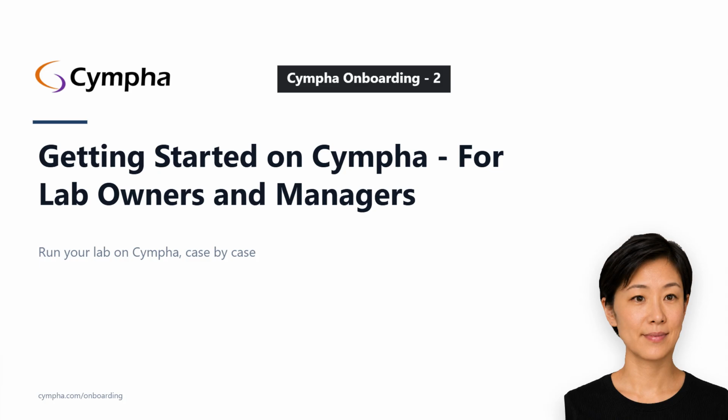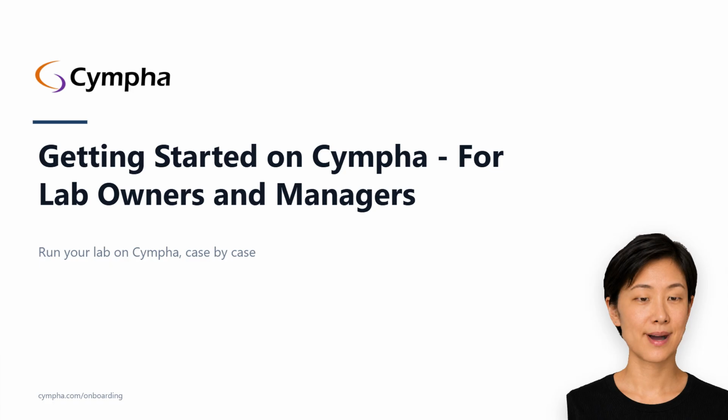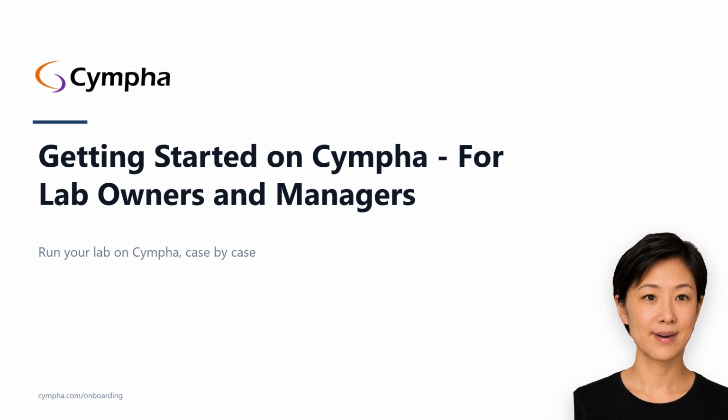Three names first, because you will hear all of them. Guide Mia is the company. Cympha is the online platform where your cases live. Guide Mia also makes desktop design programs, Ortho Plus and Implant Master, which your designers install on Windows PCs and license separately. Our worked example is Sophia, who runs Apex Dental Lab.